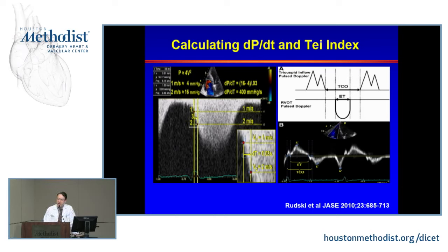The main problem of the myocardial performance index is that any time interval depends on the heart rate, depends on rhythm, and it is not a pure index of contractility because isovolumic relaxation time is related to RV diastolic pressures and RA pressure.